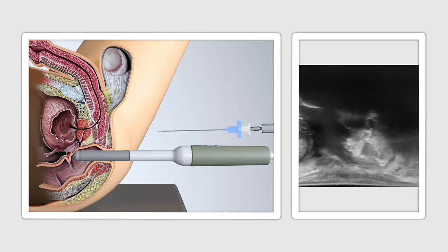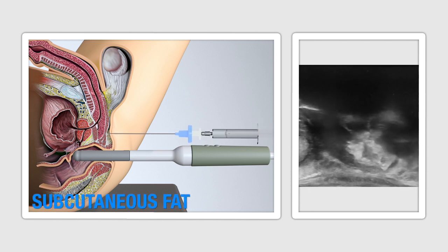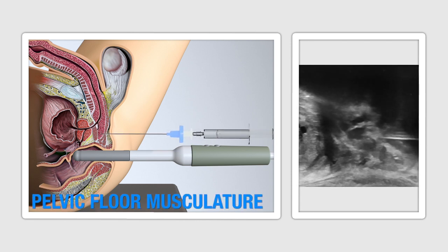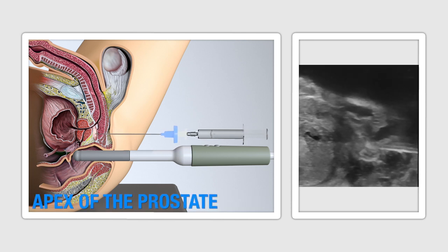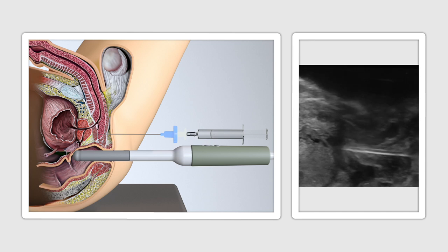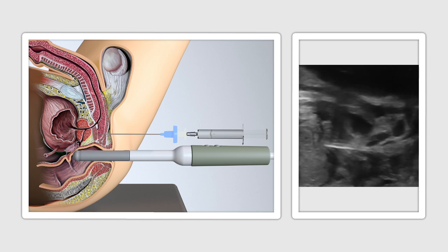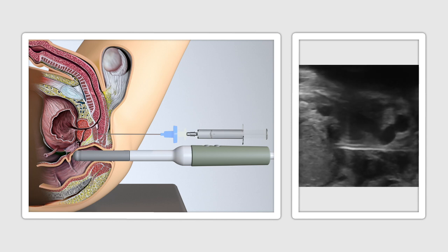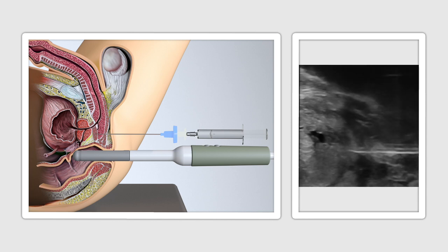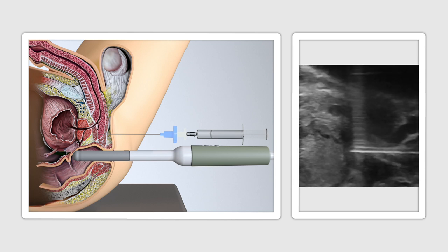As the CAMPRO probe is inserted under direct vision, structures can be visualised, including the subcutaneous fat, pelvic floor musculature, and the apex of the prostate. Patient feedback is also helpful to assess if any further local anaesthesia needs to be introduced in specific areas. Approximately 5–6ml of local anaesthesia is required per site of insertion to keep the procedure comfortable. There is no requirement for any pudendal nerve blocks, wide infiltration, or regional anaesthesia.